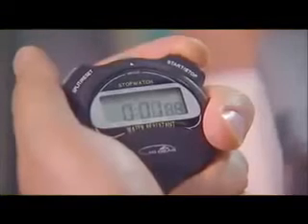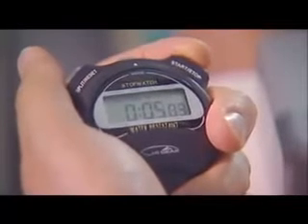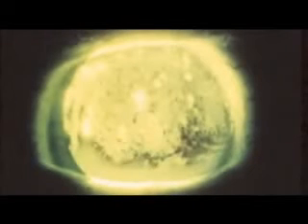At the first appearance of a distinct breakup in the fluorescein film, the stopwatch is stopped and the time noted as the breakup time. The investigator now proceeds to grade the ocular surface staining as follows.